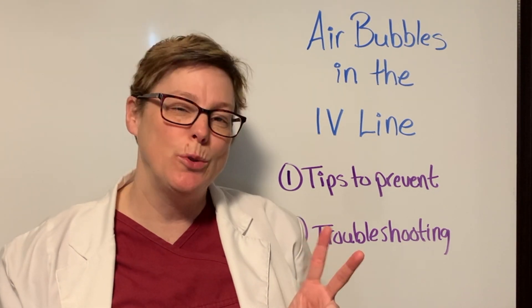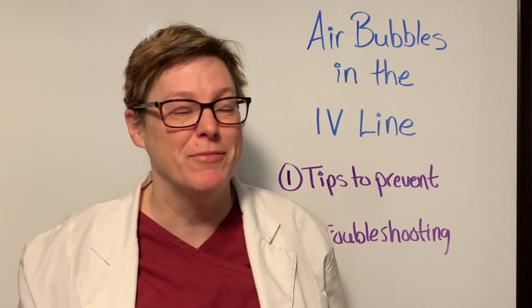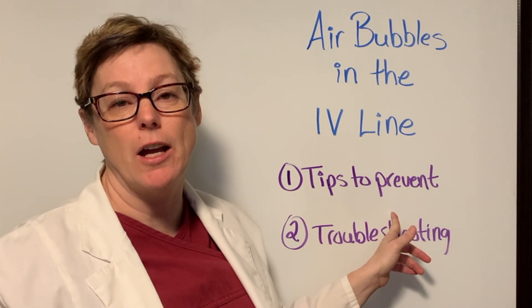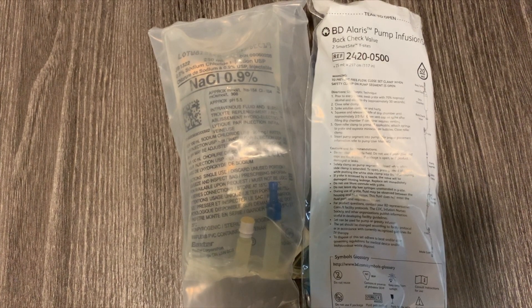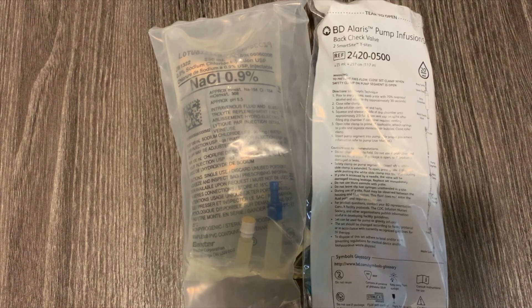Because they always seem to appear, don't they? So let's first look at our tips to prevent air bubbles in our IV line. The supplies you will need are your IV infusion fluid — in this case I'm using normal saline — and your IV line. In this case I'm using the Alaris pump infusion set.